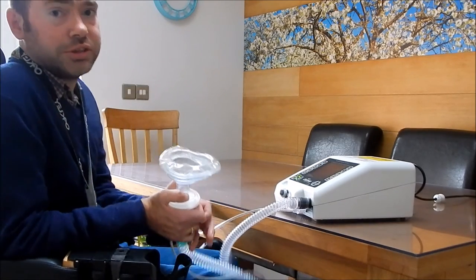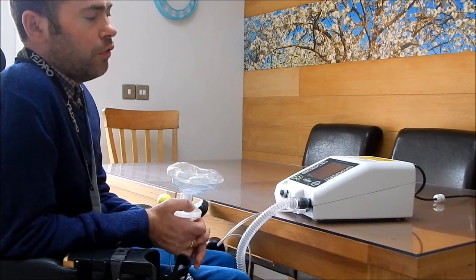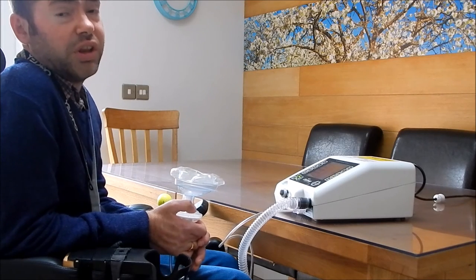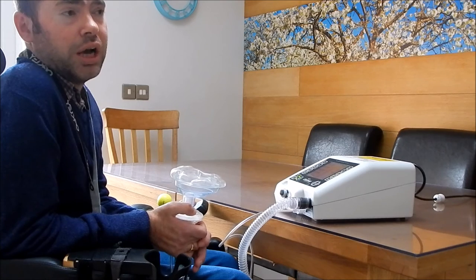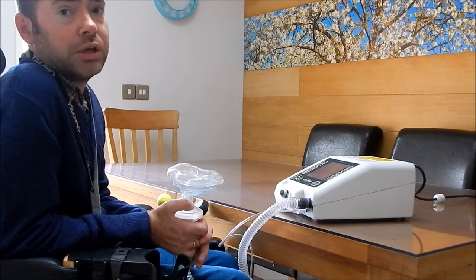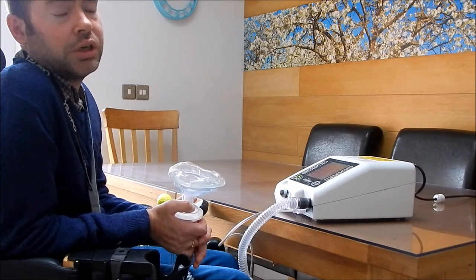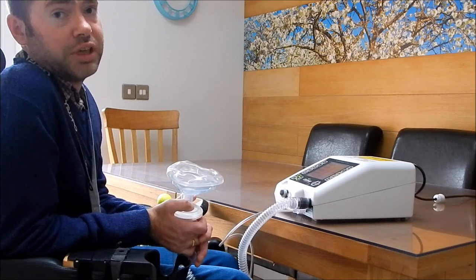Give it a chance to start up. I usually do four cycles of the machine, so that is 20 breaths in, breaths out. I do that once a day normally, but when I have a cold or suspect I have a chest infection I do it at least twice - ideally three times a day.